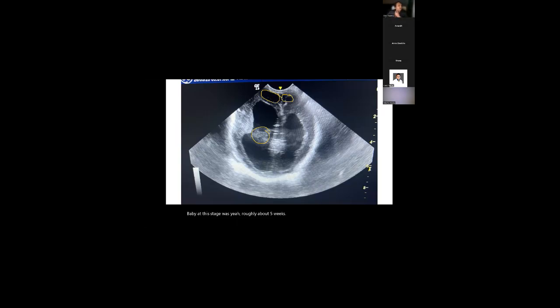5 weeks. Okay. So, infection would be the other thing for the regions. Normally, you'd start seeing leukomalacia in the periventricular areas as opposed to the frontal areas. And the only question that I'd ask is that it is very close to the meninges. So the possibility that there's infection as well can't be completely excluded. Blood cultures were negative. We did have a raised CRP, but because the baby was unstable, we were not able to do an LP. Completely understand, I think, in those situations.